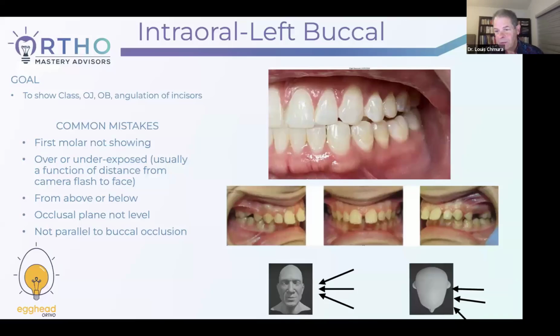And that's one that you'd love to be able to show after, because with all the spaces, you're going to take that overjet and make it significantly less just by closing the spaces. And then if you do a little bit of class 2 correction, it's going to be an amazing finish. But you're going to have these as your initials, and then your finals, no matter how good they are, are going to look funky compared to these.